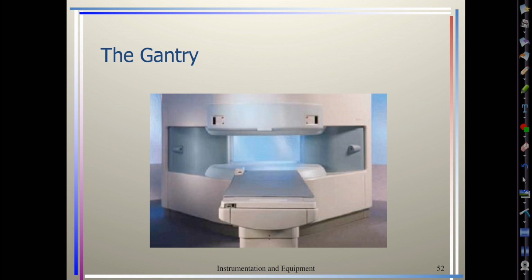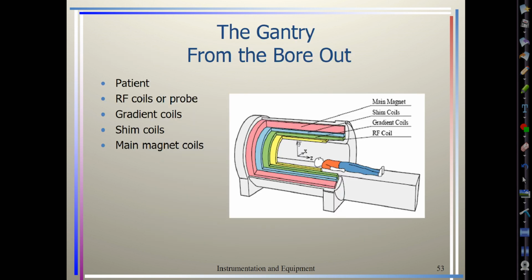So our gantry, that's really the actual magnet itself. You can also refer to it as the bore. And our bore has layers. And this is where that saying comes into play: Really good students choose MRI.